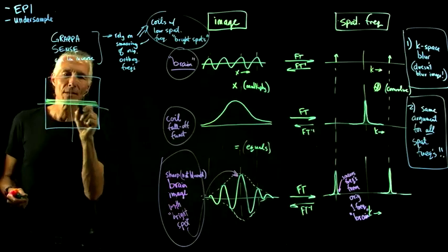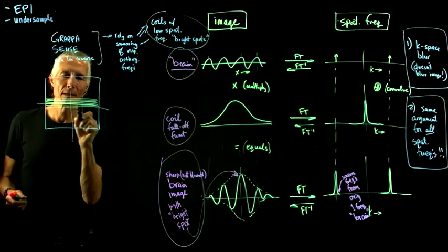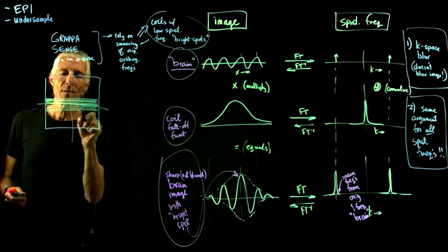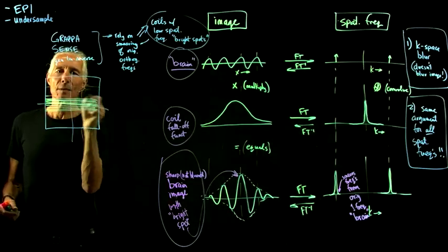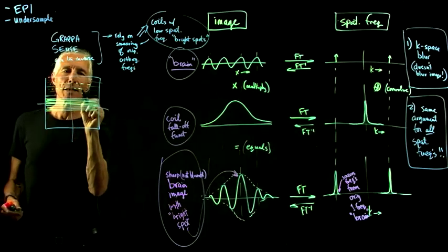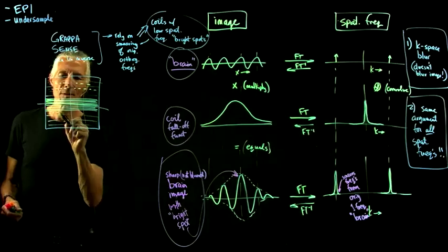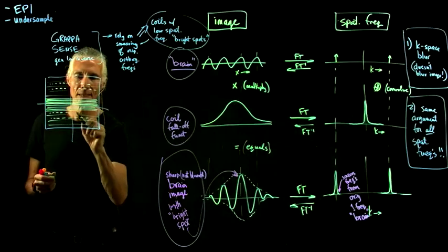Usually what they do is record all the lines right in the middle of K-space, because that's where the signal is best. So for the first scan, you can leave the outer ones blank, the higher spatial frequency ones, but right in the middle, record all the lines.